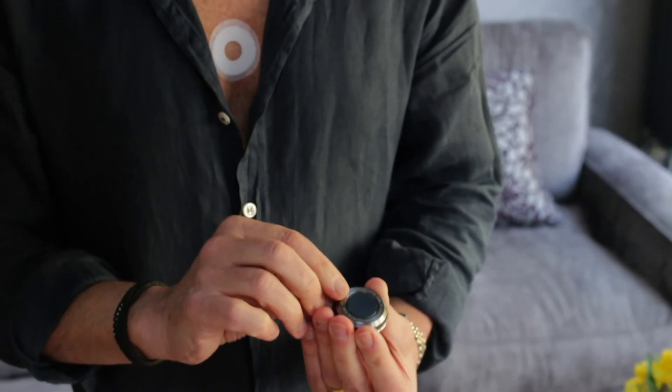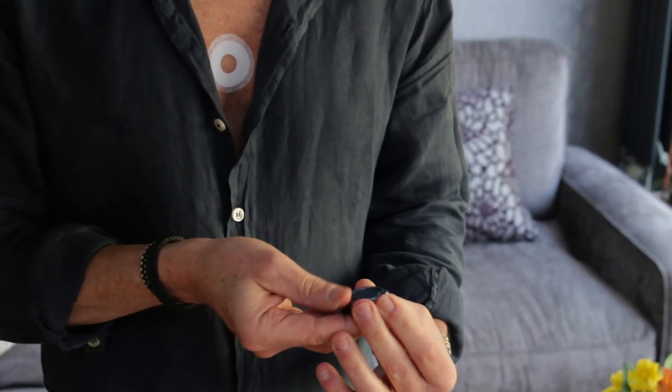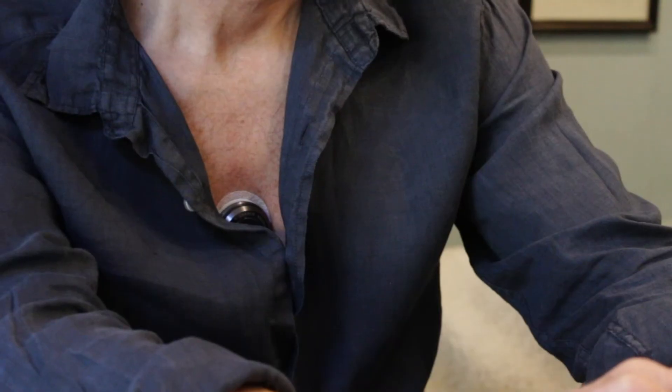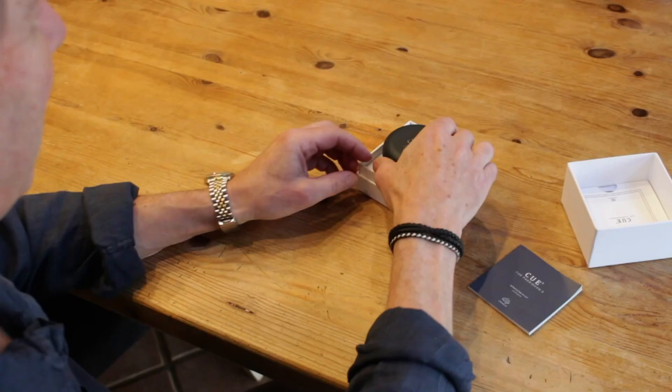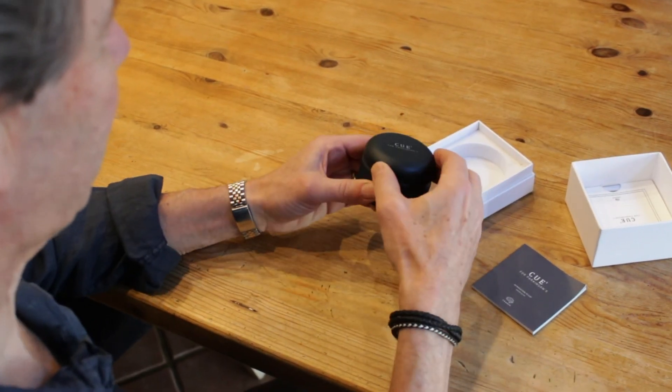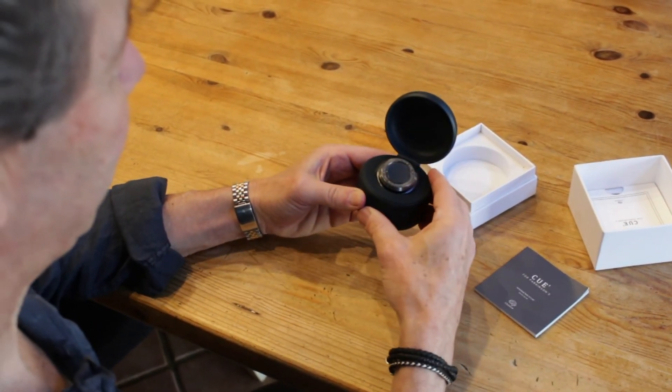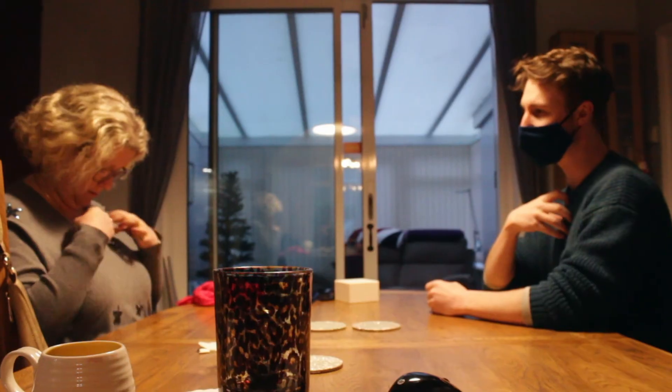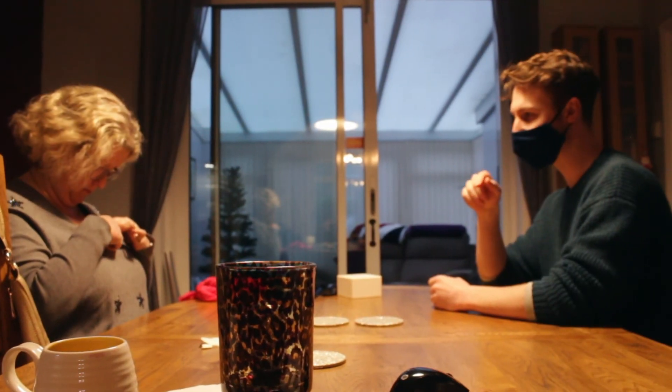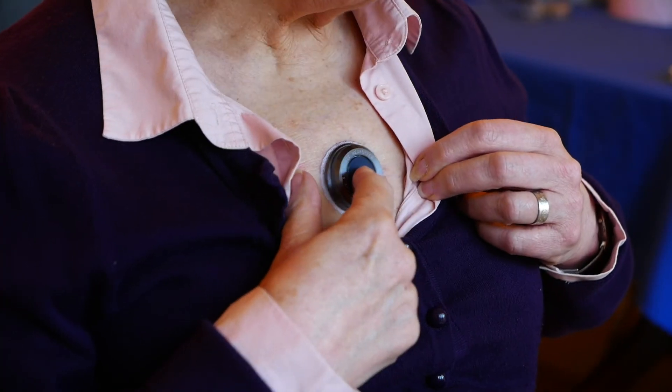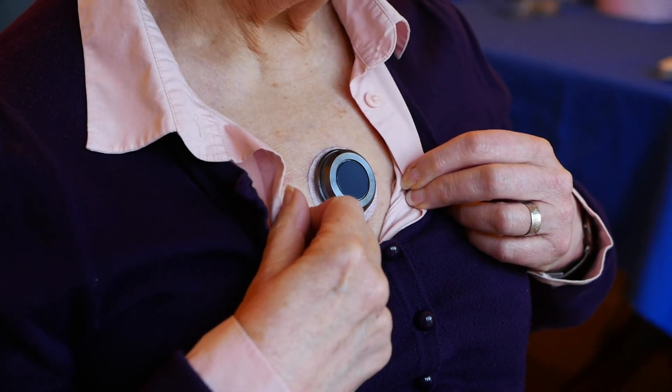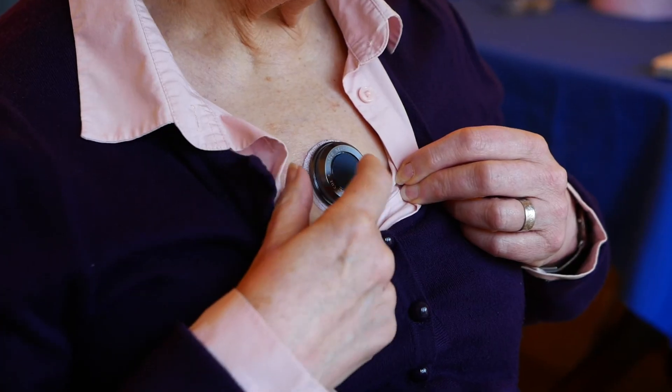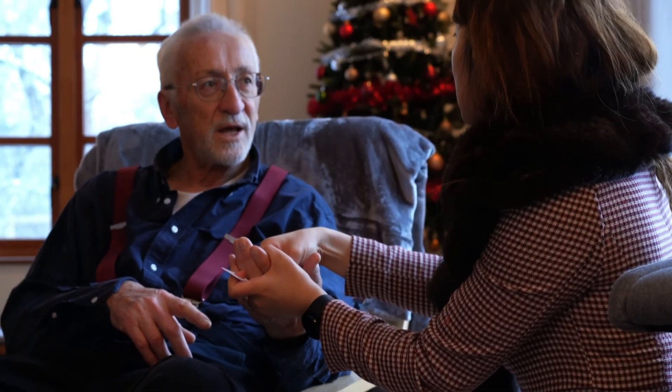Everyone is different, and some may find certain stimulation settings more effective for their symptoms or simply more comfortable than others. Your Q1 comes preloaded with settings that we've found are effective for many people, but we highly encourage you to try other settings to see what suits you, especially if you find the default settings less effective than you'd hoped for, or are having trouble getting used to the sensation.